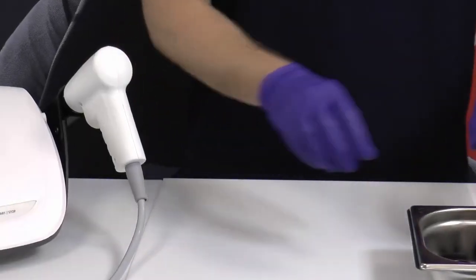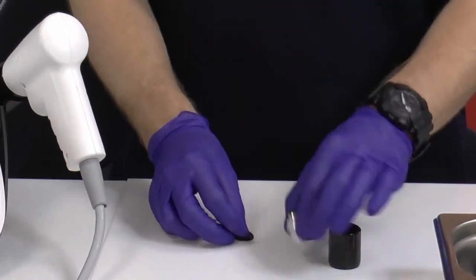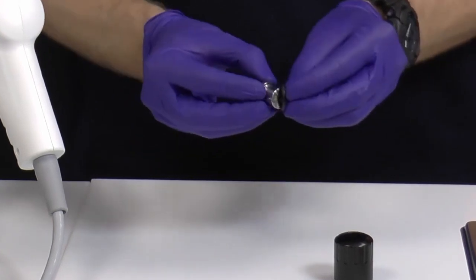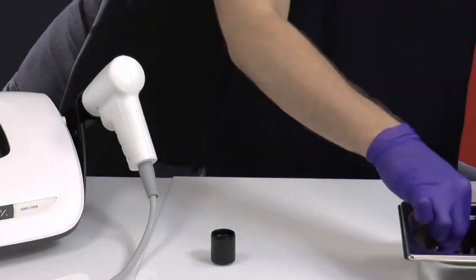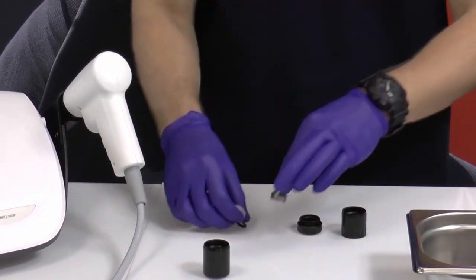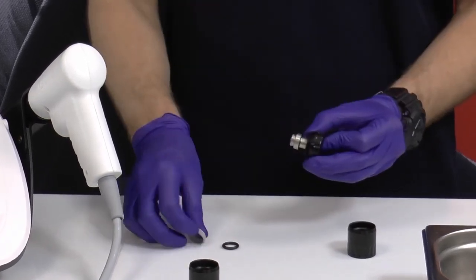Reassemble the transmitters. In the case of the 15 mm transmitter, put the smaller O-ring, 12 by 3 mm, on the rear part of the pin and the bigger one, 13 by 3 mm, on the front part and insert it into the cap. In the case of 20 mm and 35 mm transmitters, insert the metal pin through the front part of the cap and install the elastomer spring as shown.